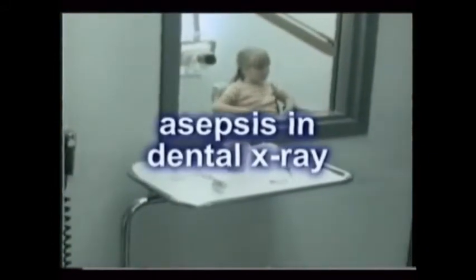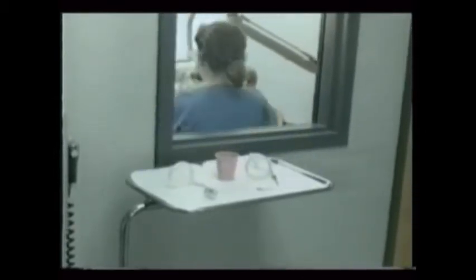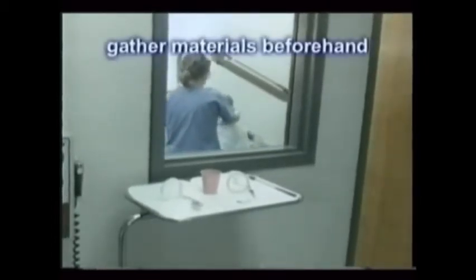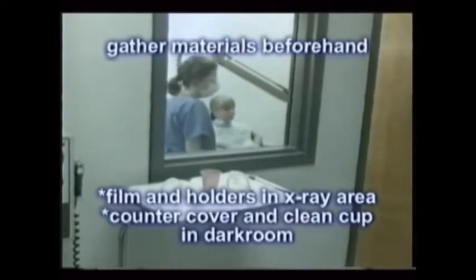There is a simple system of asepsis that is very effective in dental x-ray. It uses disposable cups and works all the way from the x-ray room through to the dark room. Basically, all needed materials are gathered beforehand — the films and the holders in the x-ray room, the counter cover and the cup in the dark room.